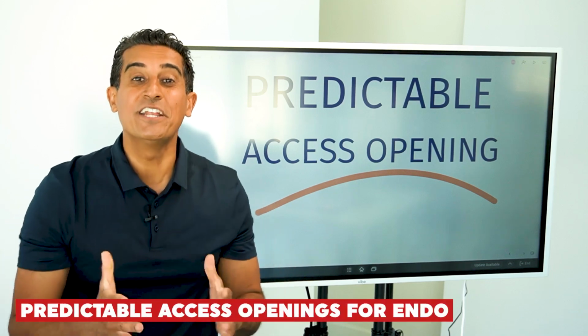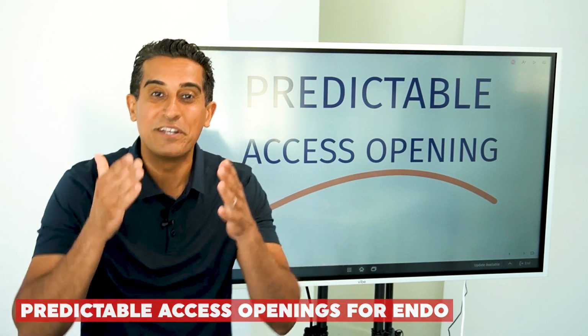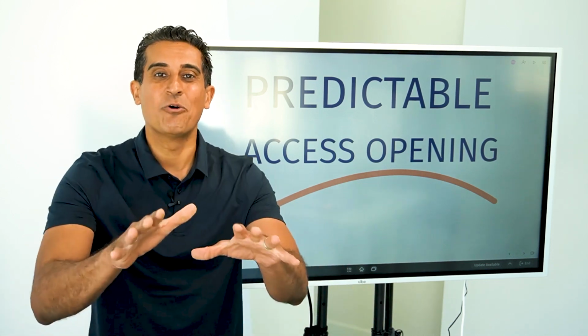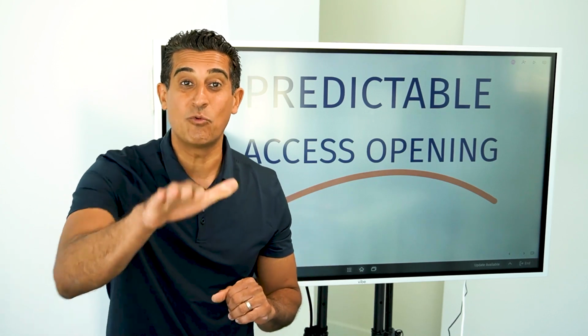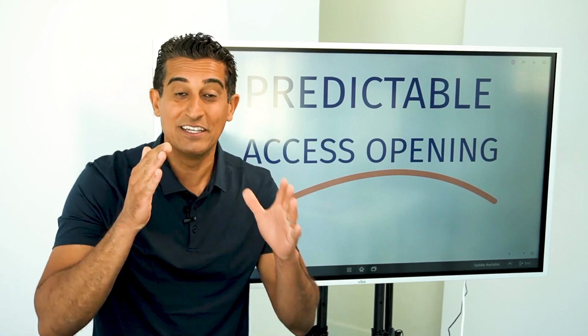Okay, so you're getting ready to do endo and you have to do the access opening. So how do you do a predictable access opening for any tooth, for any endo case? We've got Dr. Brett Gilbert here. He's going to walk you through exactly what he does chairside with his access opening.